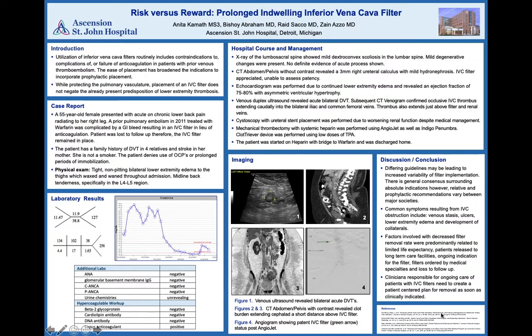Figure 4 shows the patent IVC filter indicated with the green arrow status post thrombectomy. The patient's wavering creatinine was eventually attributed to thrombotic occlusion and gradually declined to normal levels after treatment. The patient was started on heparin with eventual bridge to warfarin and was discharged home.